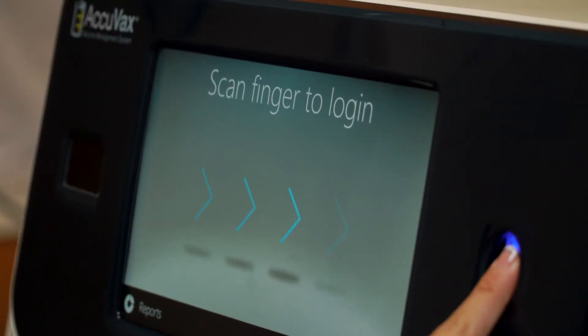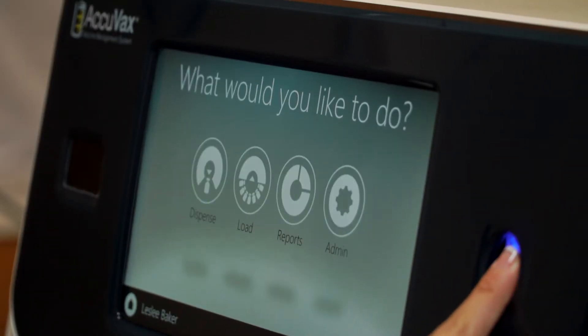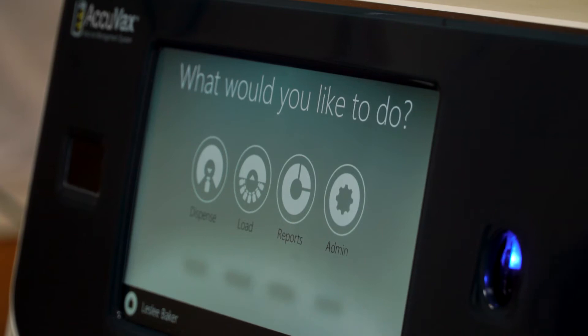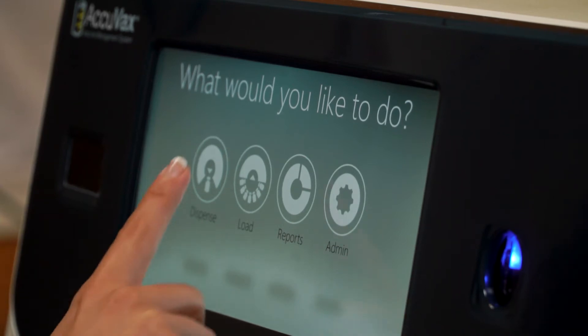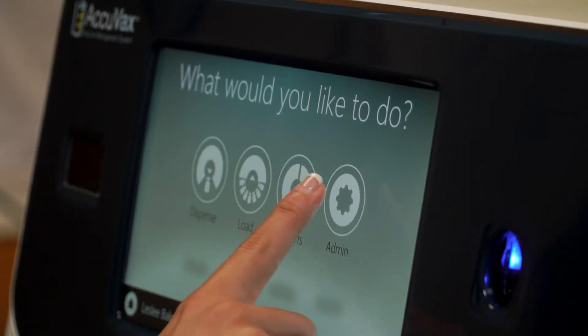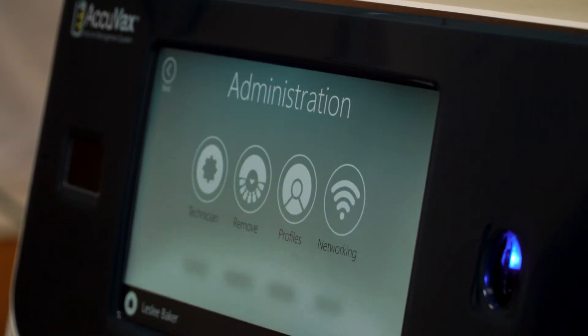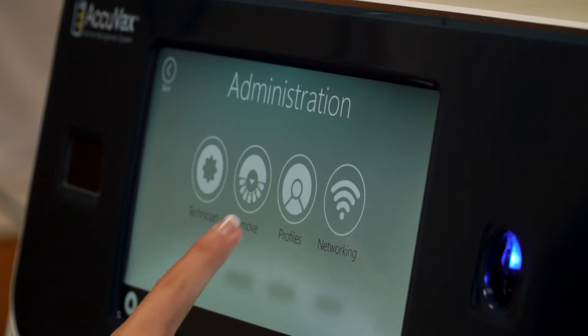Next, select the admin icon to access the administration menu. Once there, follow these steps to add a user profile.